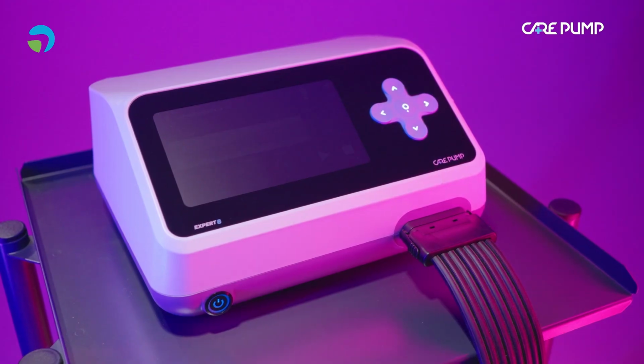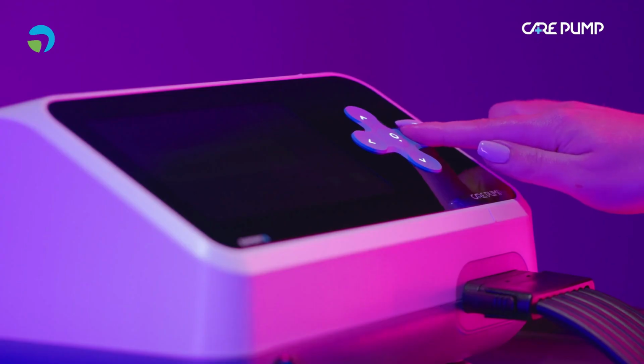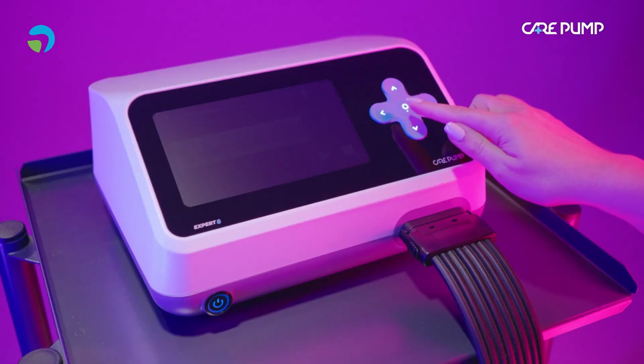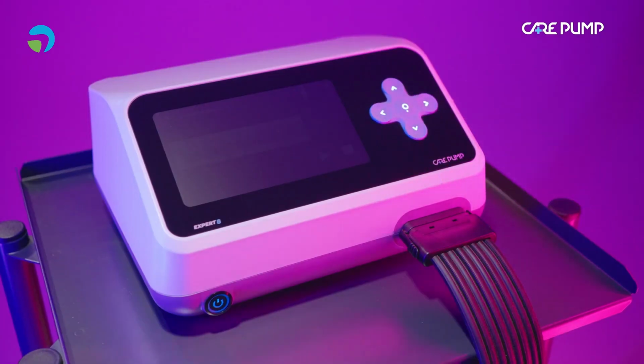Time 50 minutes. 45 minutes. Speed 5. 4. Chamber 1. Pressure 215 millimeters of mercury. 210 millimeters of mercury.